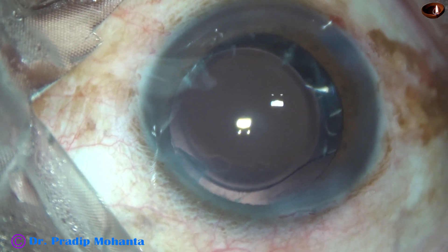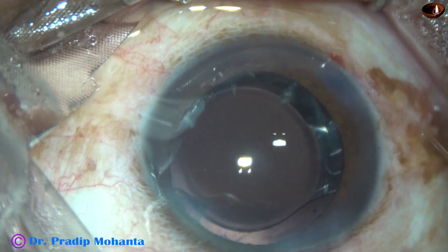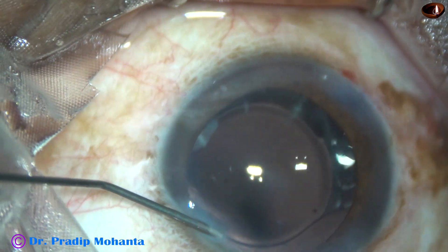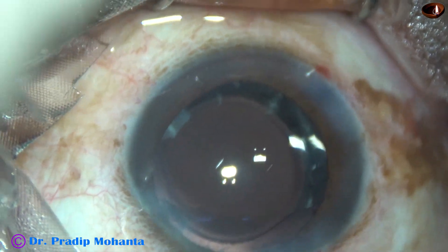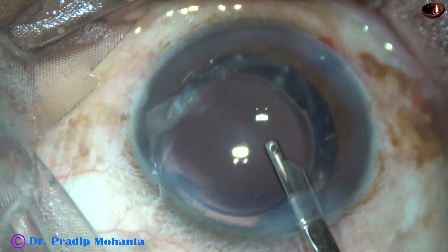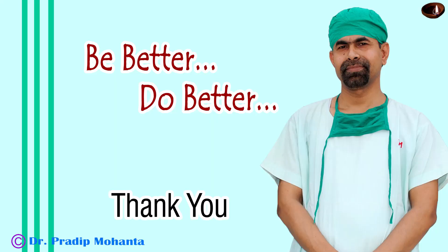300 mm of mercury vacuum and 30 ml per minute flow rate. This is a bit of Moxifloxacin. The side ports are closed by hydrating the corneal stroma with a 27 gauge cannula and BSS. The anterior chamber is nicely formed and the case is concluded. Thank you very much for your attention. Hope this video will help you in developing your surgical skills and inspire you to take on challenging cases and face the challenges boldly and with great competence.